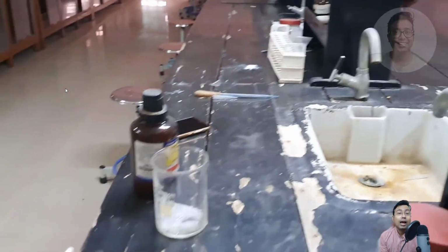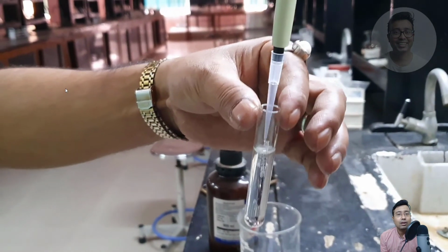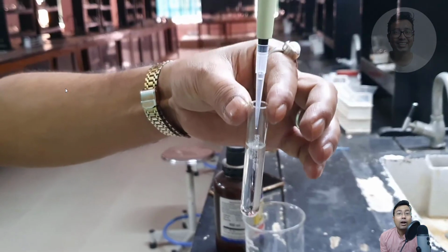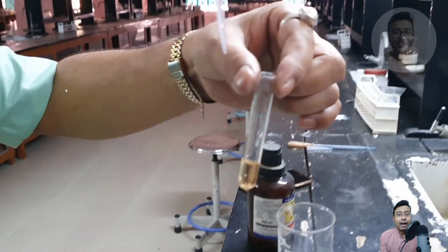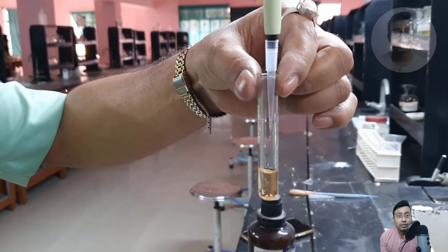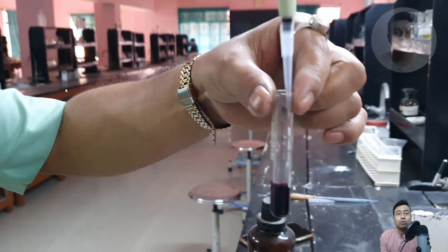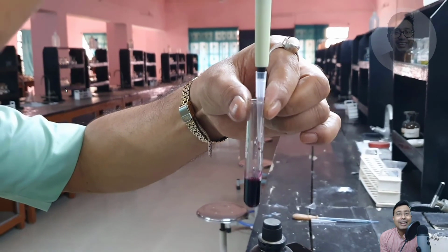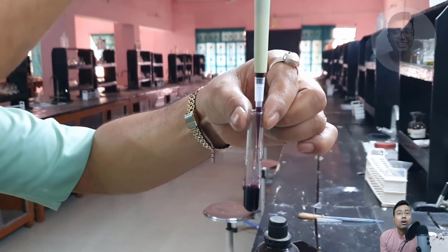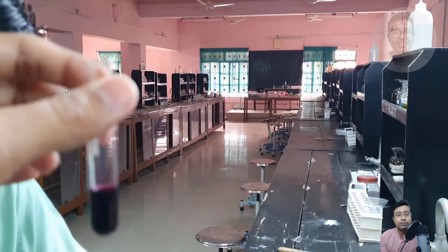Now this is a urine sample of a known case of Homocysteinuria, and this has already been treated with sodium cyanide. So the free thiol groups are everywhere. Now if we add 100 microliter of this sample to the ammoniacal solution of sodium nitroprusside, you can see immediately it will give a strong reaction, and this pink, reddish purple color you cannot miss once you get it. This is a very characteristic color of thiol.